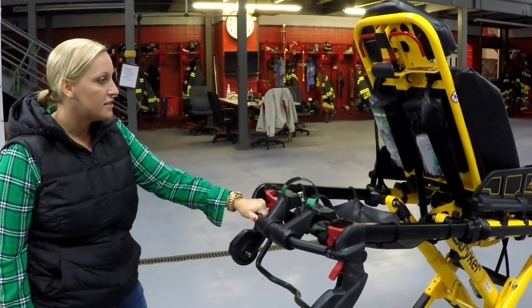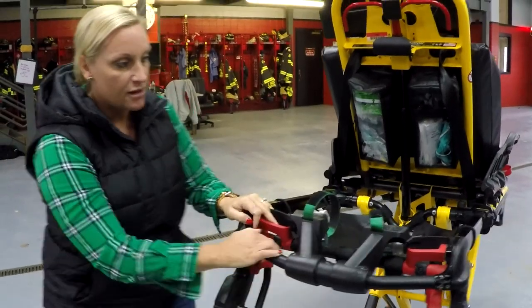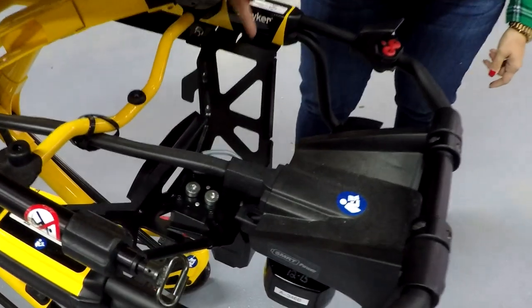There are two ways to tell if your cot has been power load upgraded. There are silver pins on your load wheels, and on the foot end there's a wiring kit that you can see right here.